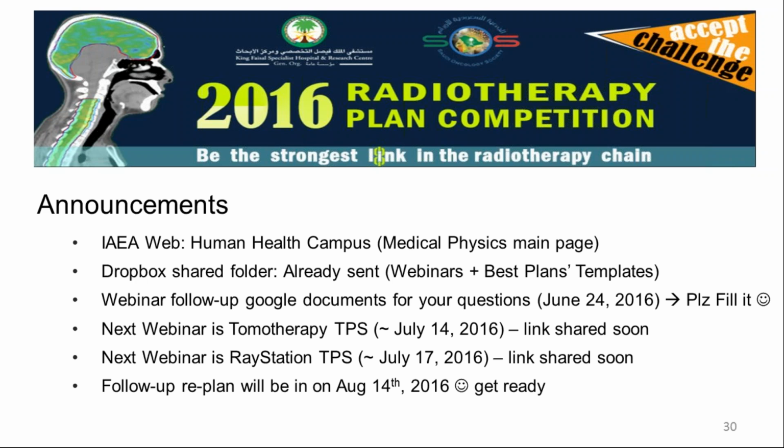But I would really suggest and recommend that anyone who would like to start not look at these best plan templates. I would like you to start your own and try your best, and after that you send me your plan, and I can evaluate it and send you back the results. Then you can follow the guidelines in the webinar, as well as the methodology of the best plans, in order to see how you can improve. But if you look at the best plans right away, you will not learn anything.